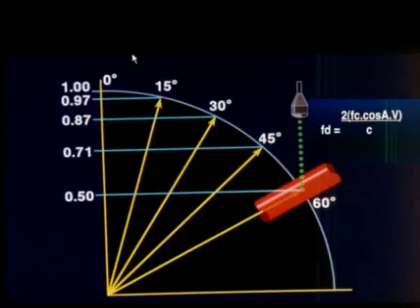And before I continue, I would like to give you a few concepts in Doppler ultrasound. In this slide, it is represented the relationship between the cosine of an angle and its value. As you can see, if the angle becomes greater than 0 degrees, the cosine value becomes smaller than 1.